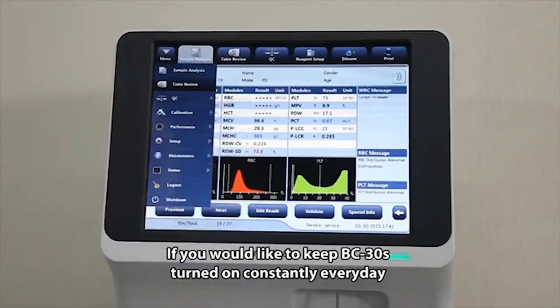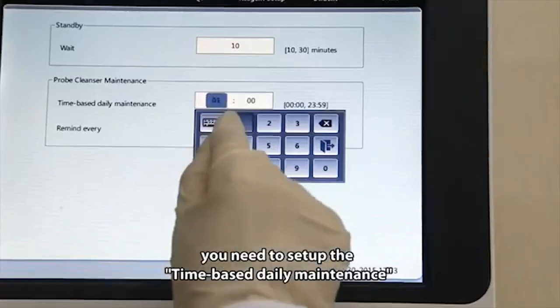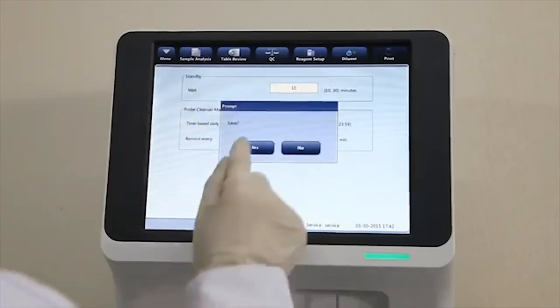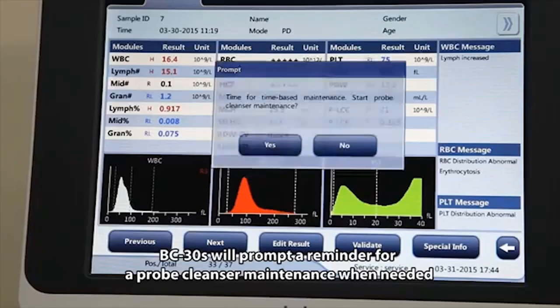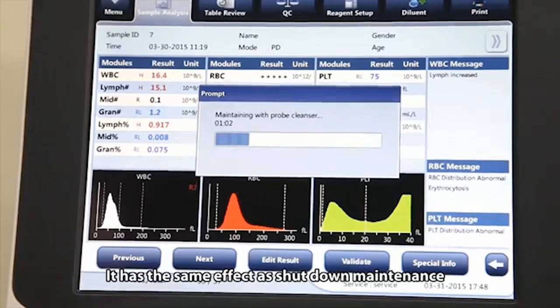If you would like to keep BC30S turned on constantly every day, you need to set up the time-based daily maintenance. BC30S will prompt a reminder for a probe cleanser maintenance when needed. It has the same effect as shutdown maintenance.